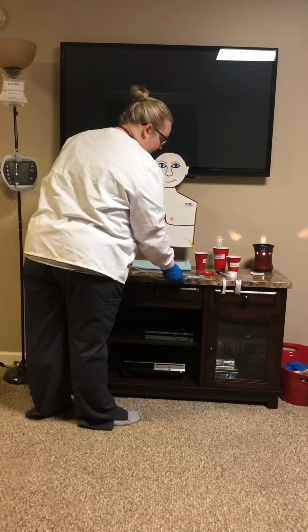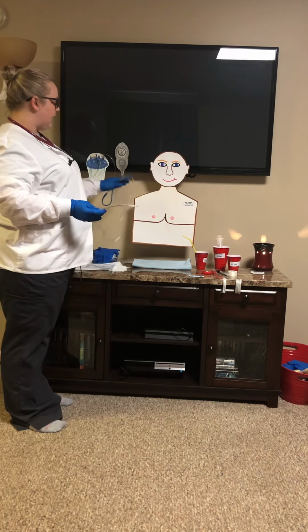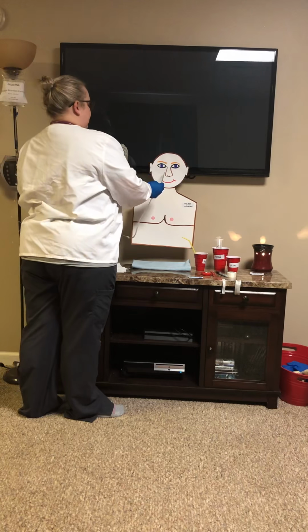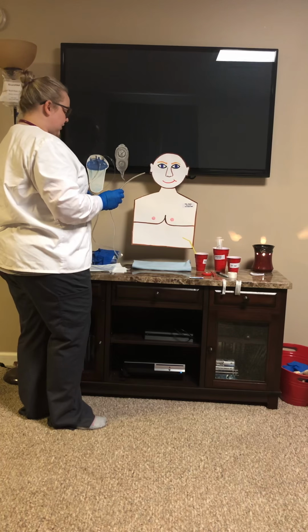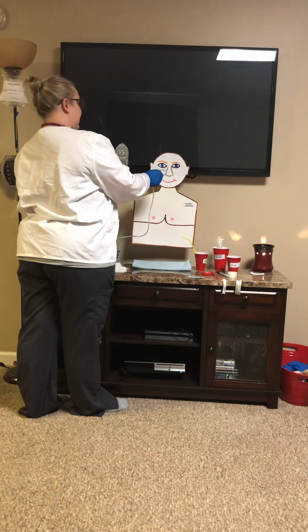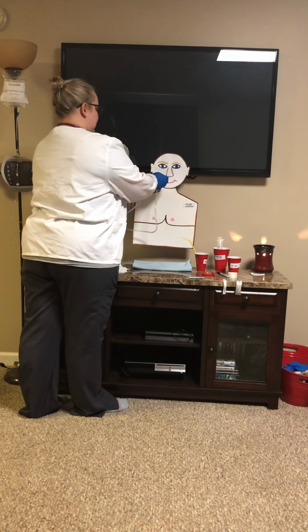I would lube the distal end 1 to 3 inches. I'm going to have my patient in a high Fowler's position, and I'm going to start inserting the tube. Mr. Doe, when you feel like you're going to cough, tilt your head towards your chest. He is tilted back at this time towards his pillow, and I'm going to start progressing the tube. And he starts to cough.